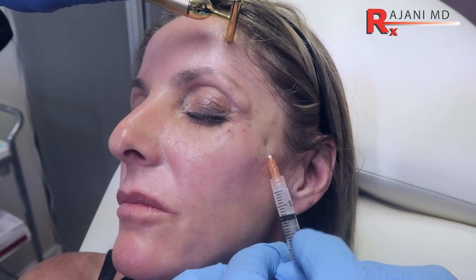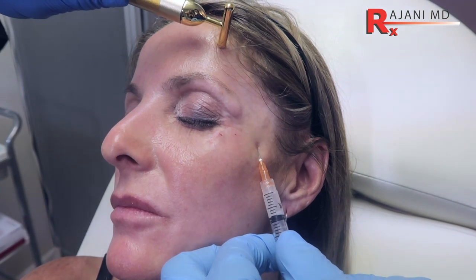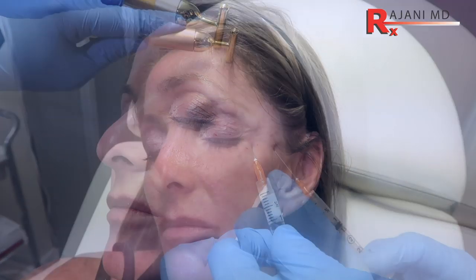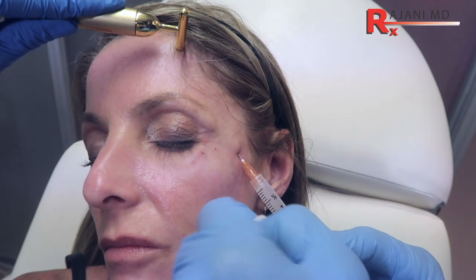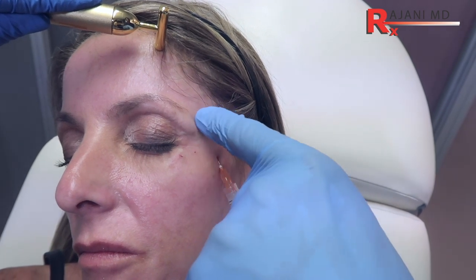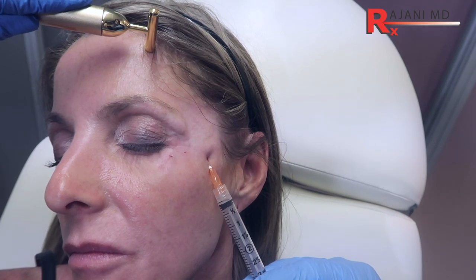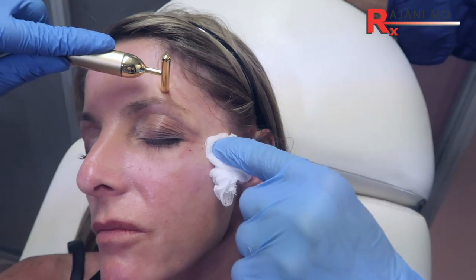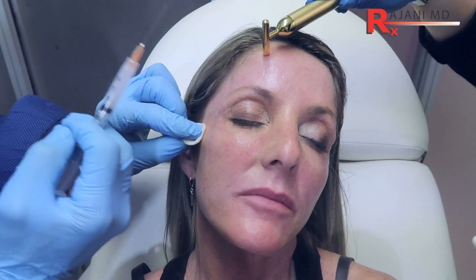Reposition and walk up the periosteum. If you get a little clog, you push back and inject. We're going to come up here and inject just over the brow right there, and we're going to bolus after pulling back. Filling here will help lift the brow — perfect. Another cc in there, and then just hold a little bit of pressure. We like pressure.